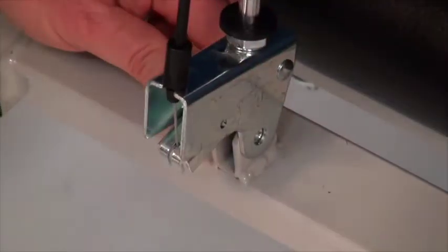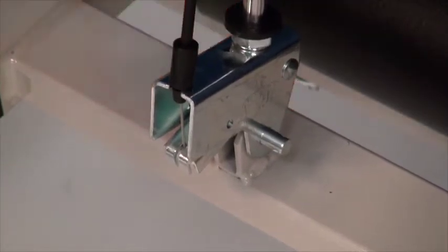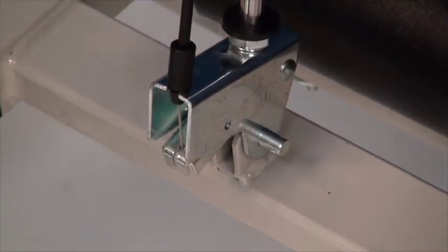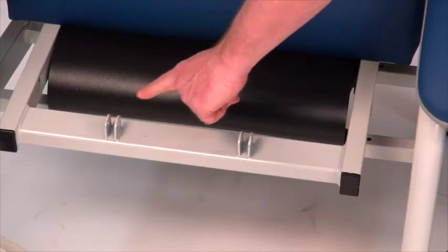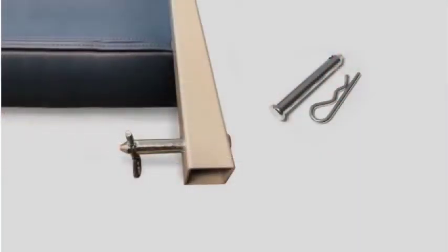The FR-577RG will have a single U-bracket and the FR-587W will have two. Prepare the back of the recliner frame for assembly by removing the clevis pins from the back frame and the bottom of the gas springs.